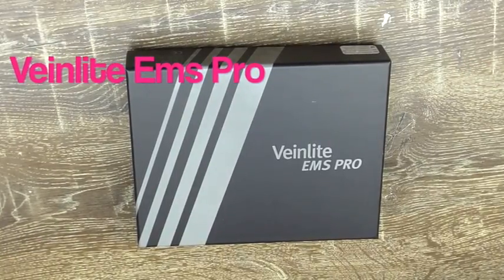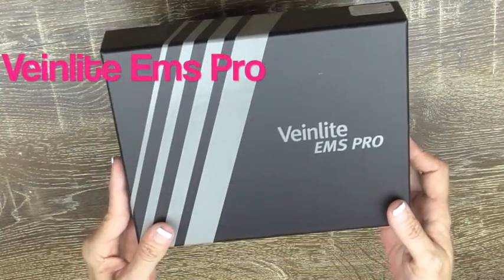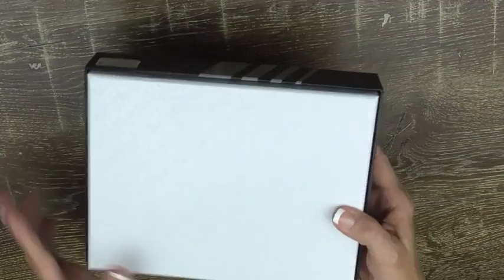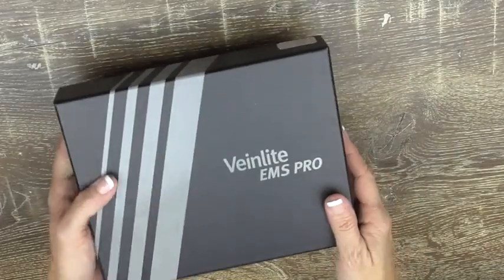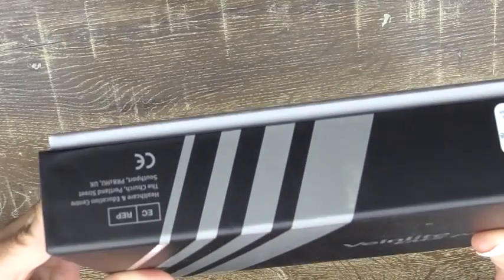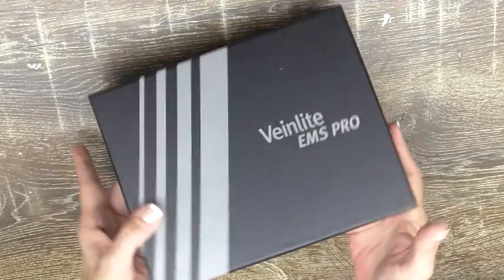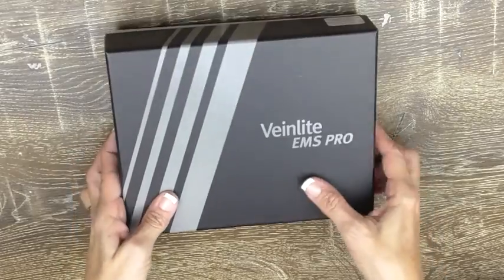Hello, my name is Anya. I'm really excited — I wanted to share with you what I got in the mail today. It's my Veinlite EMS Pro. The box is pretty plain and there's not much information on it, but it does say it's made in the USA. So let's go ahead and have a look and see what's inside.